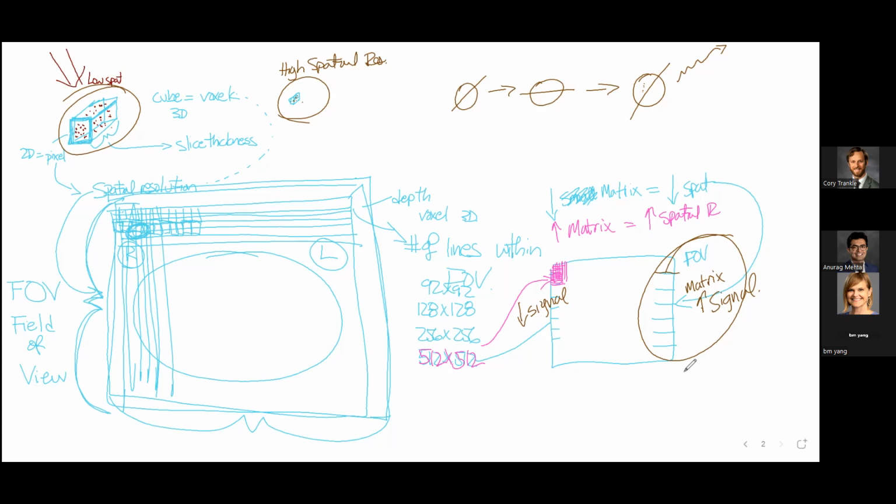All right. So what I want you to remember, we talked about having to set the size of our picture. We've got a very complicated piece of machinery. We're going to talk about next week how we make those cine movies. But each time you walk up to it, you are setting the size of the picture. It's not like an echo machine.